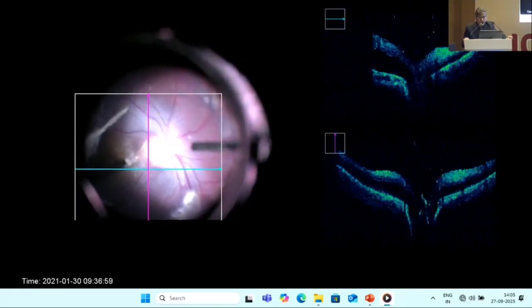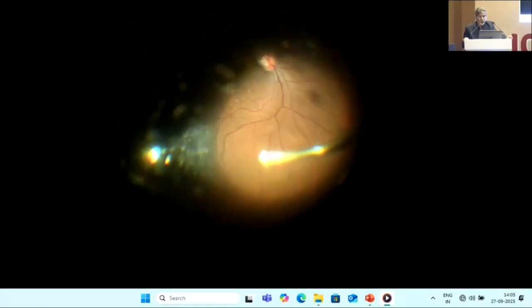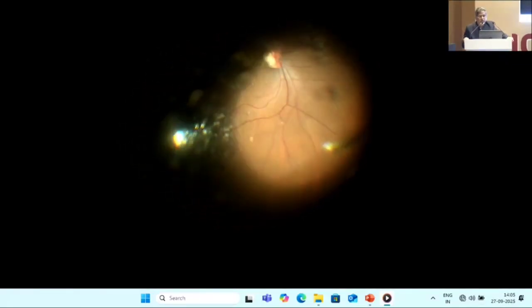There is a membrane or adhesion which has been shown by the various OCT, spectral OCT. And in the OCT here also, we can see whether there is a thinning of the fovea or not, so that we should be able to avoid it. Still people are doing ILM peeling just for the sake of plugging of the pit, but that is easily available. But to me, it is very difficult to plug. So there is another method. People are putting amniotic membrane and scleral tissue. So we have already put this scleral tissue. Thank you for your kind attention.